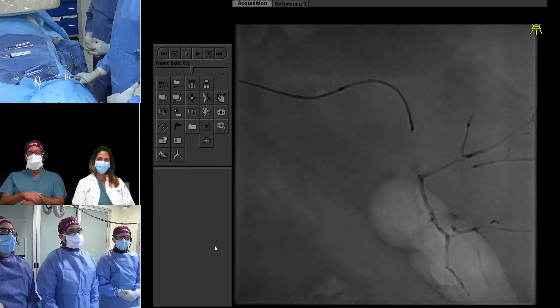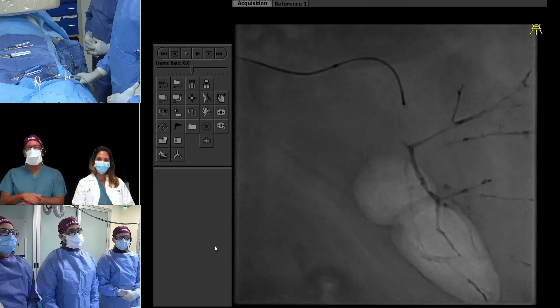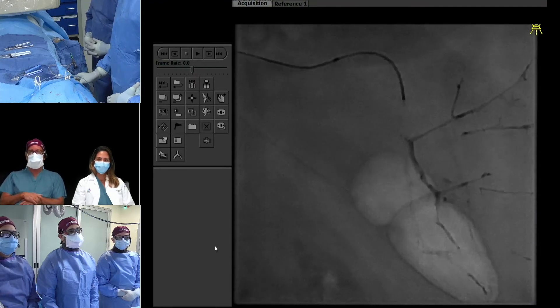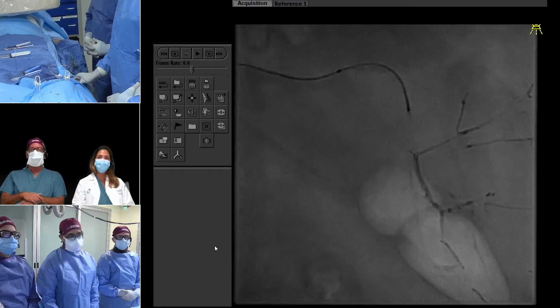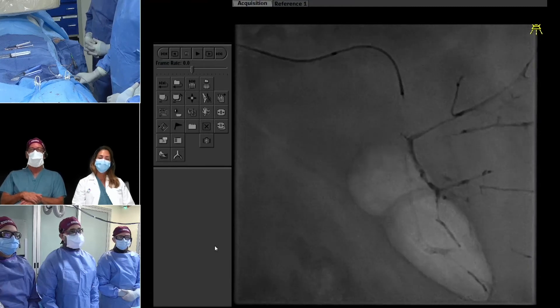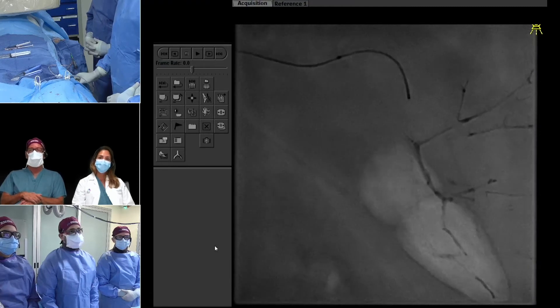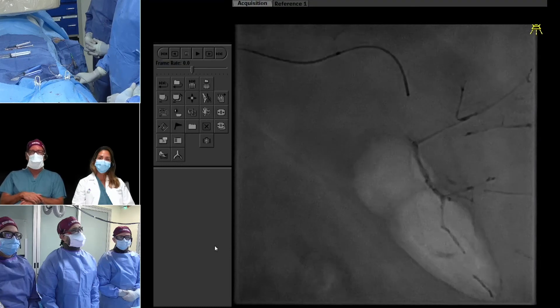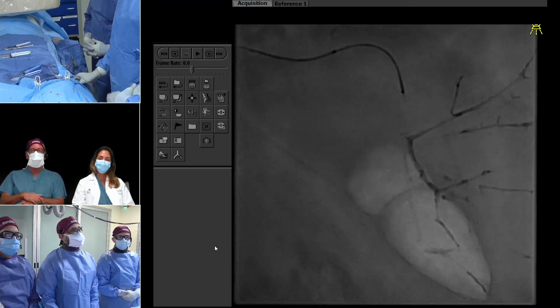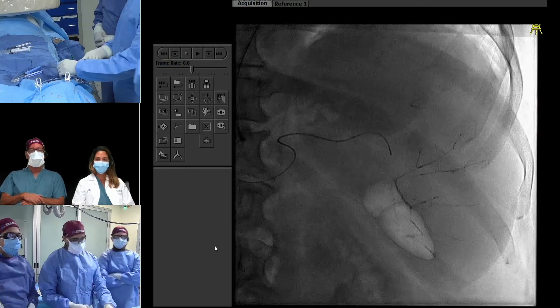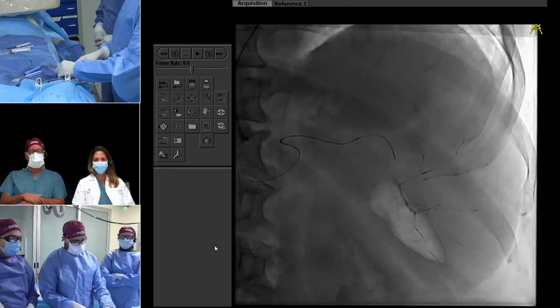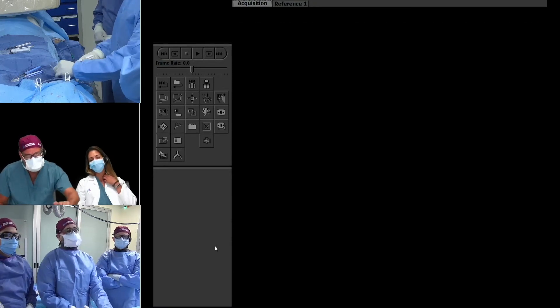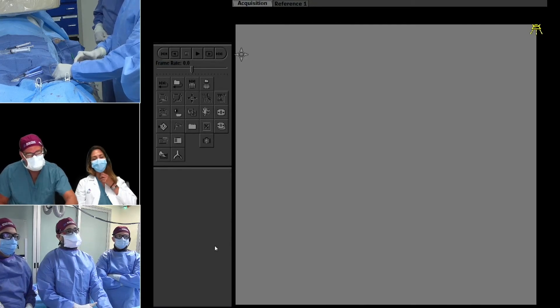You're using the Onyx like it's glue, basically, which is a very interesting technique. The fact that there's a stopgap between the bifurcation and the tip of the catheter is really fascinating. If we think we're going to move forward — it didn't fill as much as I thought it would. I think we'll do Onyx 34 in the next go-around.